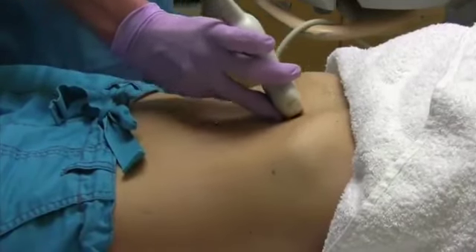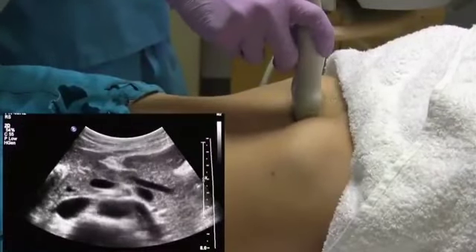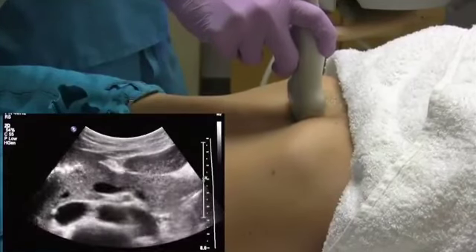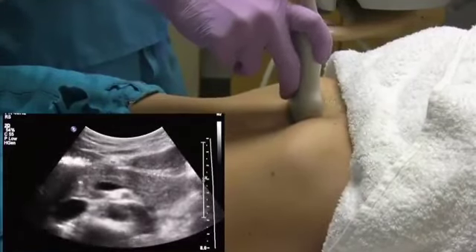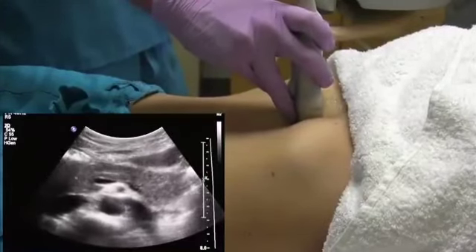The other key is to oblique your transducer slightly counterclockwise. This will set you up for a nice sagittal pancreas image.